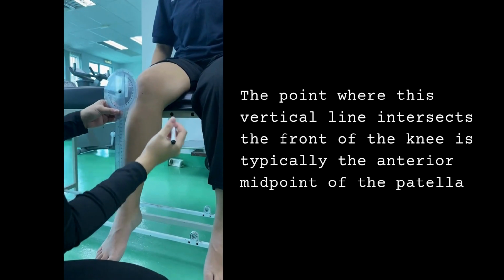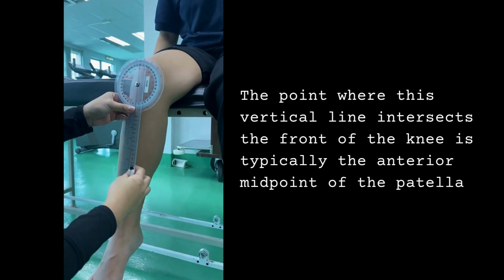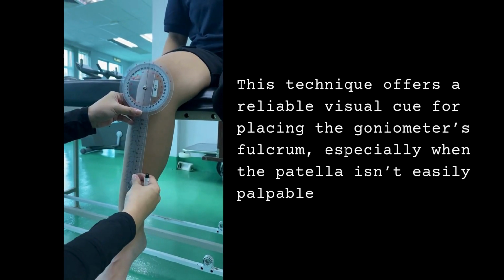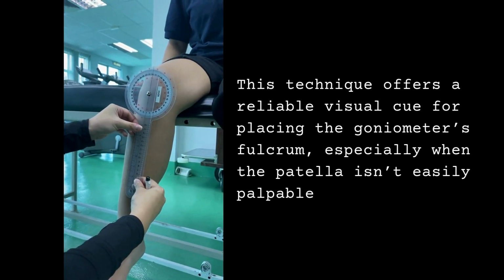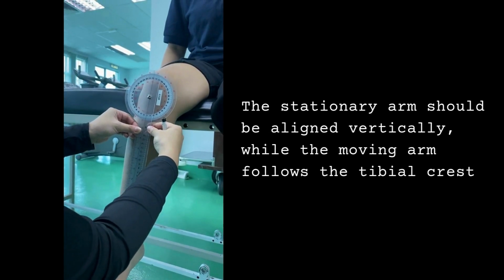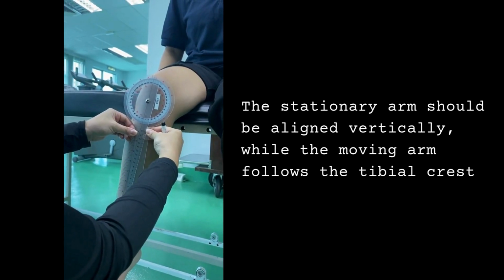The point where this vertical line intersects the front of the knee is typically the anterior midpoint of the patella. This technique offers a reliable visual cue for placing the goniometer's fulcrum, especially when the patella isn't easily palpable. The stationary arm should be aligned vertically, while the moving arm follows the tibial crest.